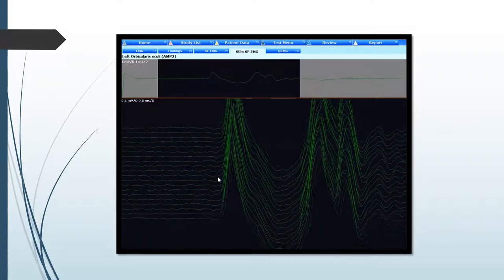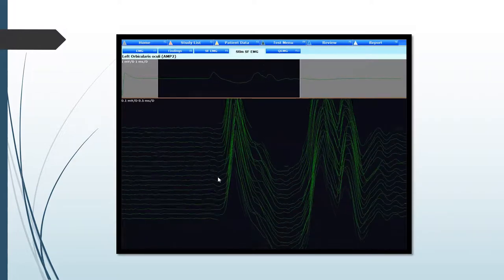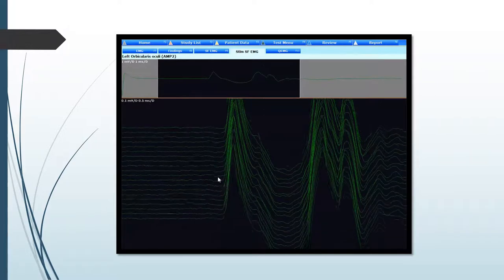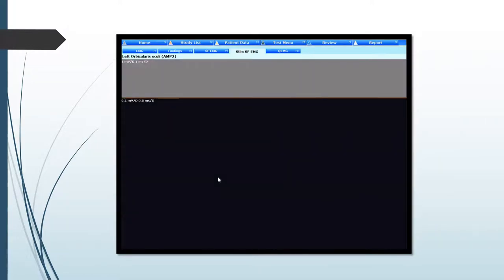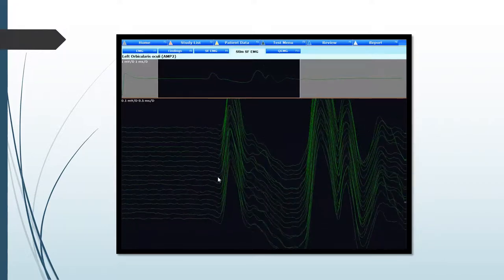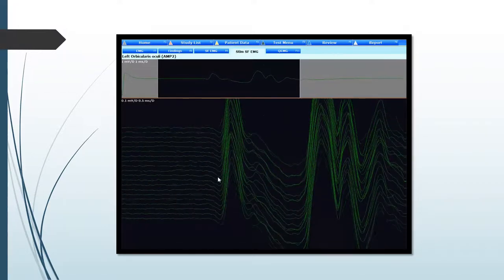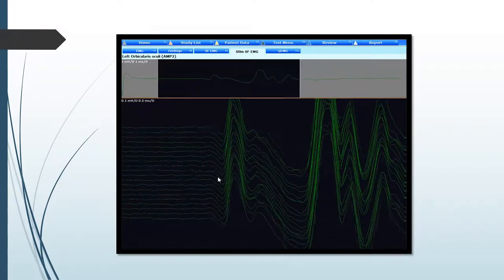You can see on the screen a set of three stimulated potentials. They're all occurring at pretty much the same synchronous timing, and you can only really hear one sound, which is very regular and is in time with the stimulation spike. You can also appreciate a little bit of jiggle here, which is normal — the minimal jitter I've talked about in normal healthy neuromuscular junctions.